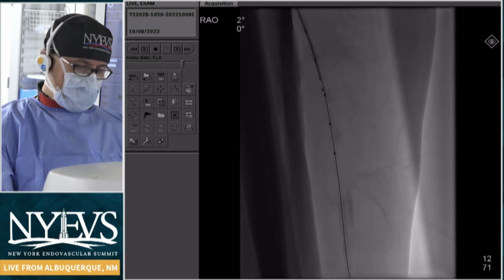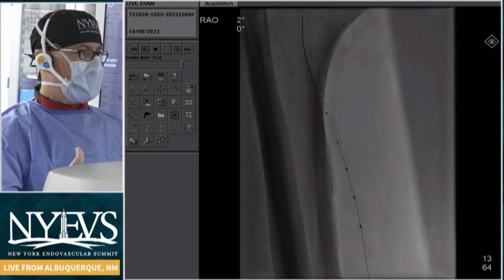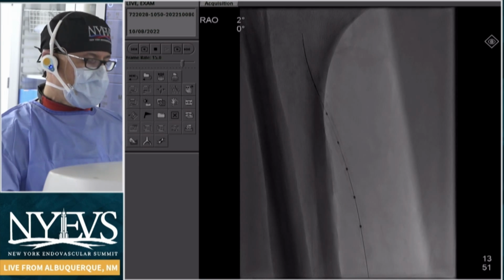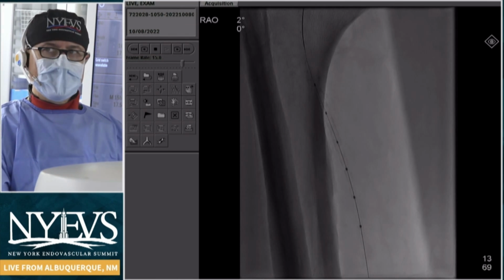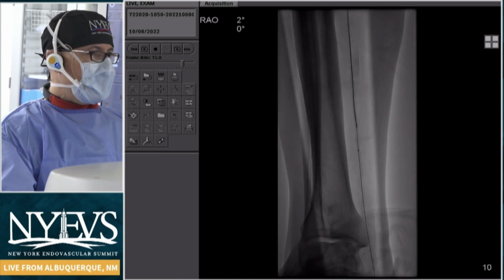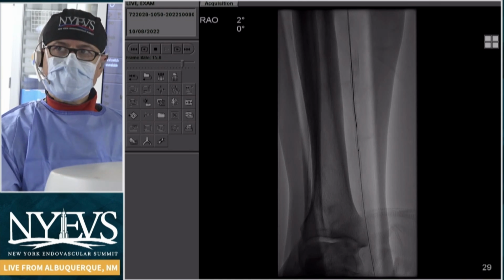And so basically that's the setup. I'm going to downsize to an 014 wire platform suitable for a number of things, including atherectomy. But before I do anything else, and I think there are some people on the panel who are as passionate as I am about intravascular ultrasound and peripheral vascular disease, I don't ever do a case like this unless I've done IVUS. So that's kind of where we're at. By all means, please fire away with any comments or questions that you might have at this point.